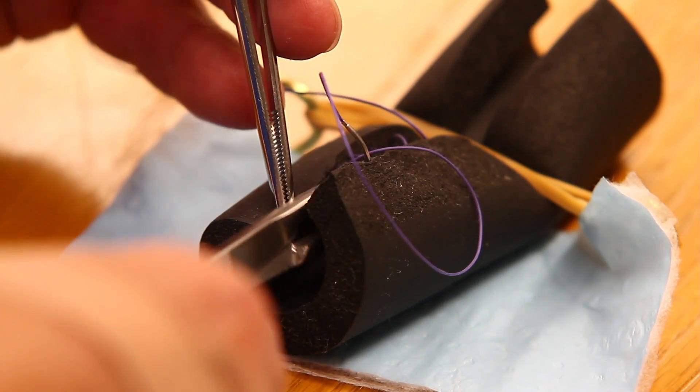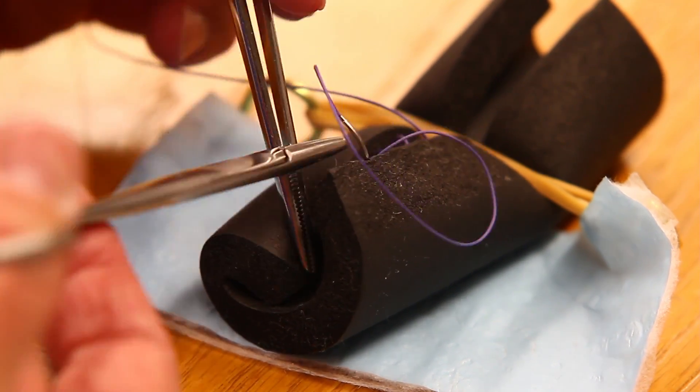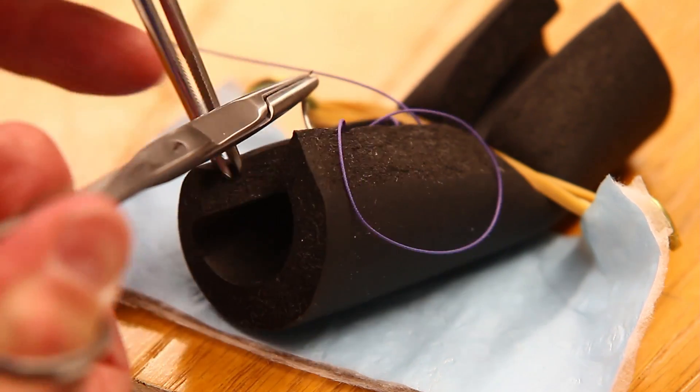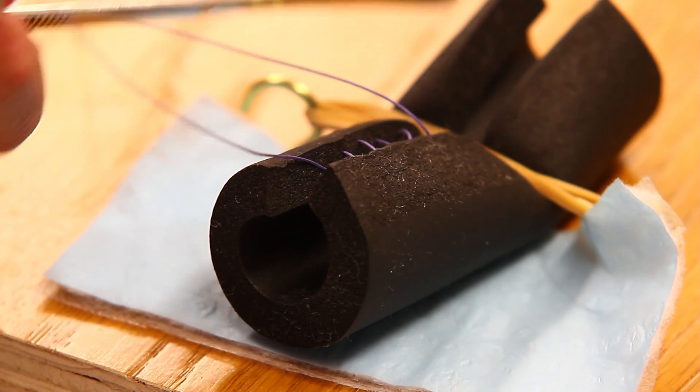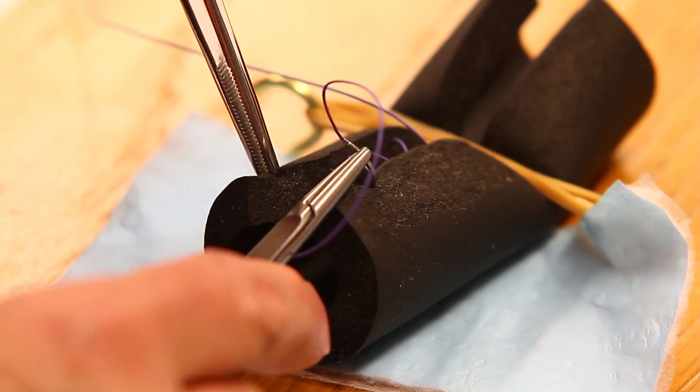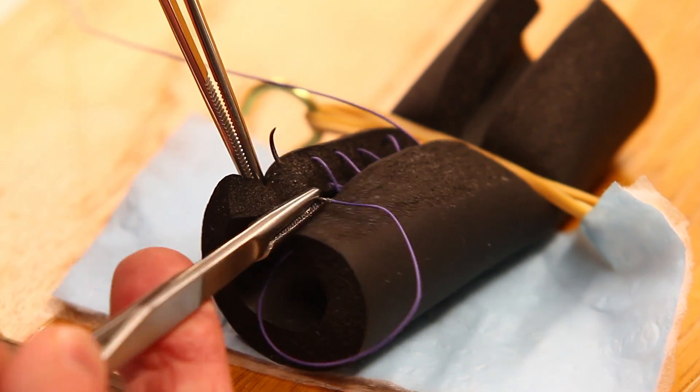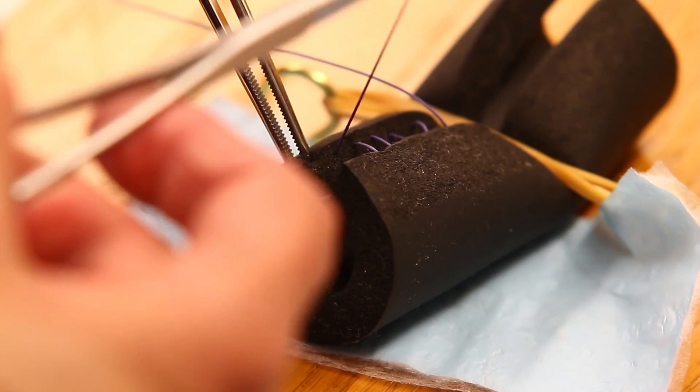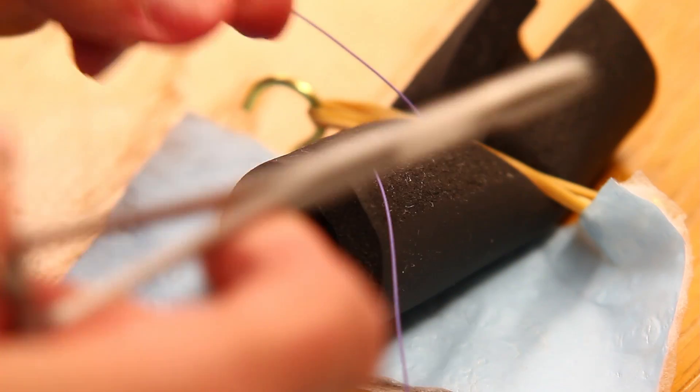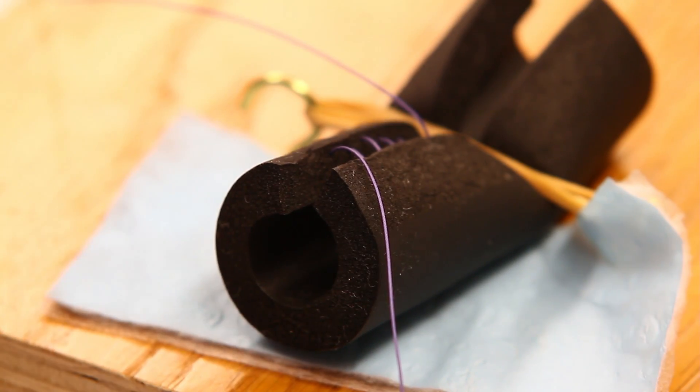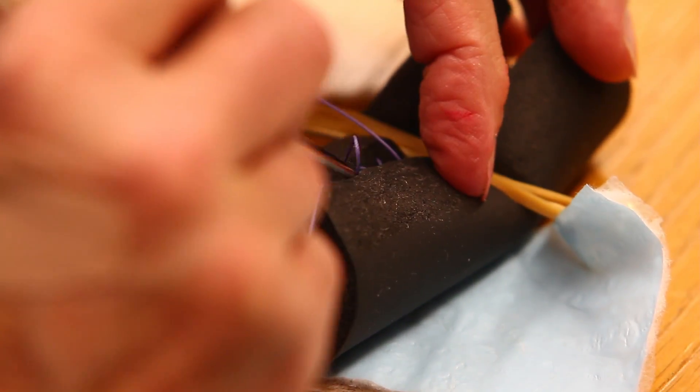Again, as you pass the needle make sure that you curve it on the way out so it doesn't tear. Follow the curve of the needle. And we'll just do one more complete one to show this repair. And don't get caught on your tools. And then you can gently use your thumb forceps to tighten things up a little bit. But gently, you don't want to be pulling these out after you've spent so much time putting them in.